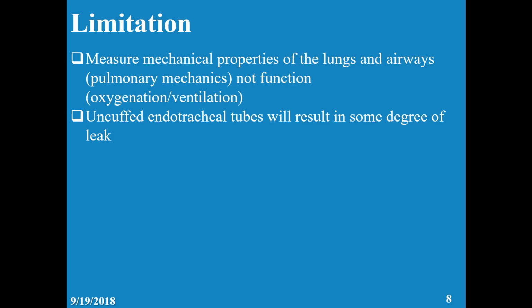Now the ventilator assumes the leak is 0. There are a few assumptions that you will learn with time. When the ventilator starts to ventilate a patient, it assumes that the leak is 0 and the outside pressure is 0. So the atmospheric pressure, which is 760, it assumes that it is 0, and the leak is 0.